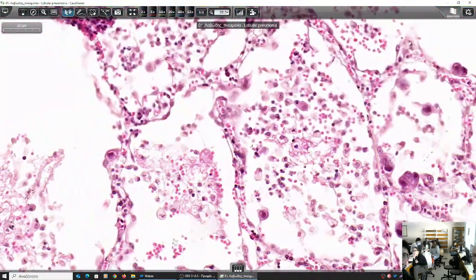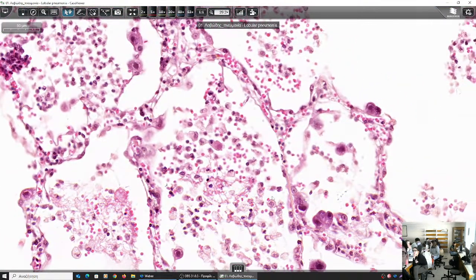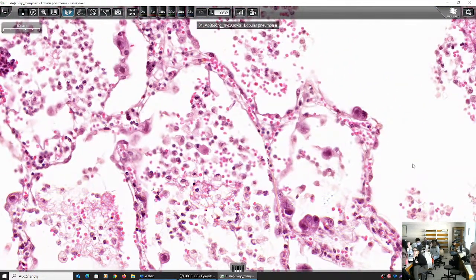Okay. Yes. Which cells do you think need some sort of explanation? It's very nice where you are. These ones. Excellent. Show them with the mouse. Great. So there are some big cells with some strange nuclei. And have a look, Edmund, here, what they have.